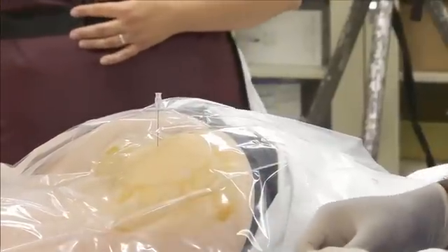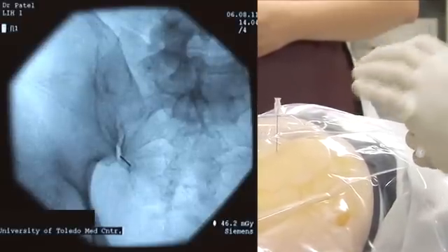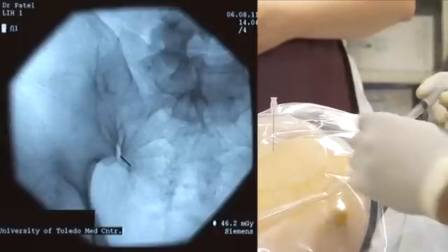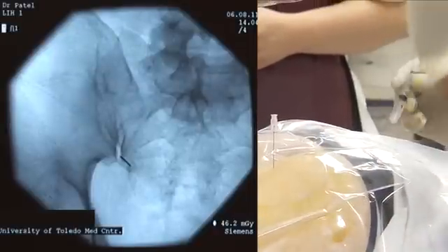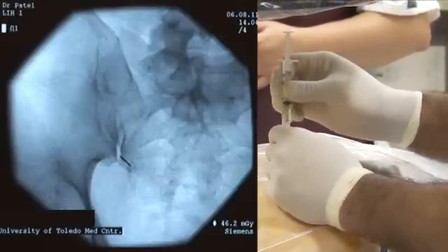At this point, when we take a look at the needle here, I'm just piercing the capsule only — I don't want to drive it through and through. What happened was I put the needle to hip bone and then walked it into the joint. Now what we want to do is inject a little bit of contrast.